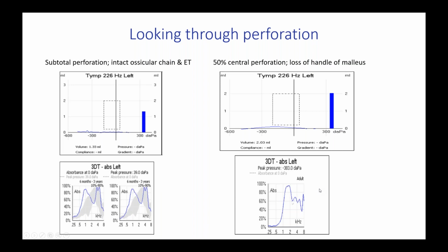So sometimes we don't get a single standard pattern when there are multiple pathologies, but if it's not indicative of any one particular dominant pattern, then you can suspect there could be something else going on with the middle ear pathologies.